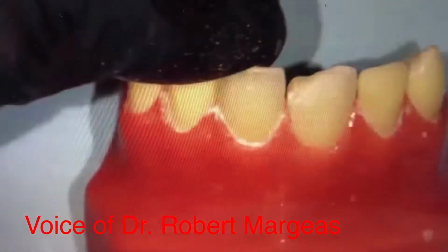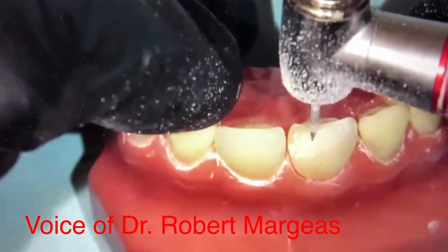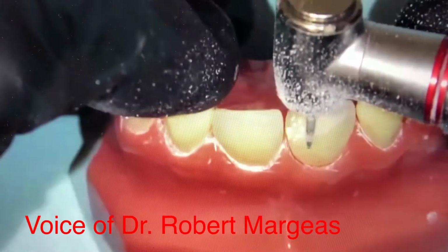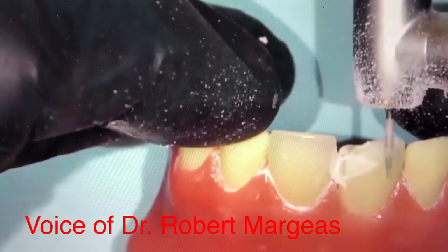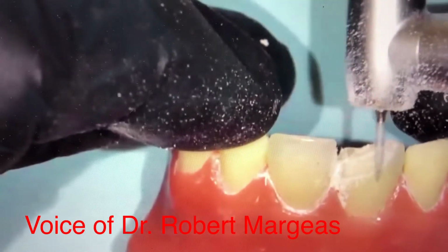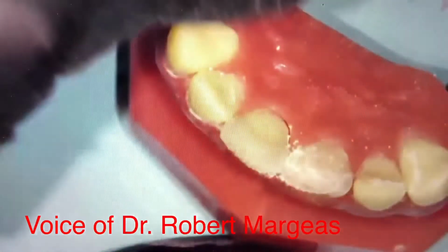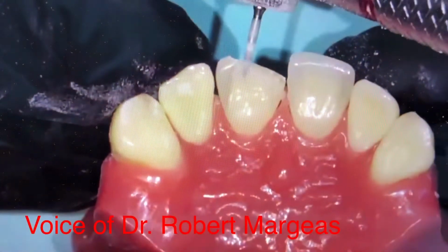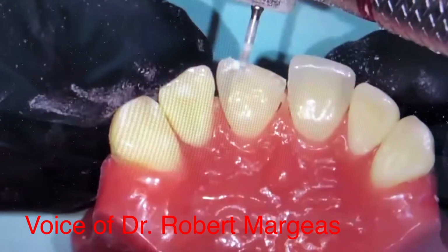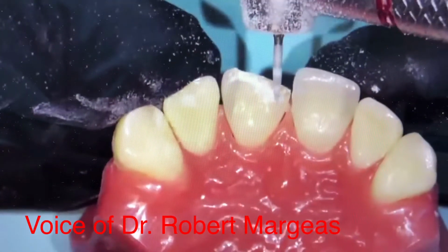that tooth. So you can see this is where the DEJ is right here. I'm not exposing it, but I'm bringing this out here like this so that I can get the material on the tooth. And then on the lingual, all I do is this. I'm going to do a small little bevel here. This does not have to be long. This can be a shorter bevel because it's not going to show.